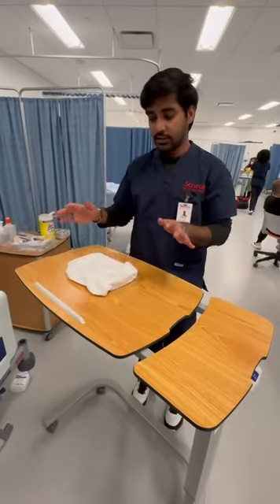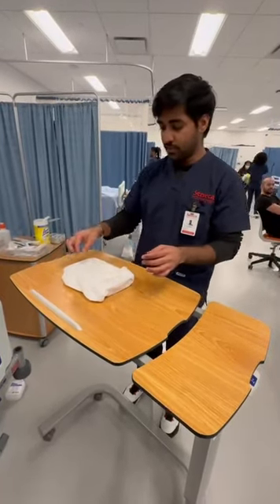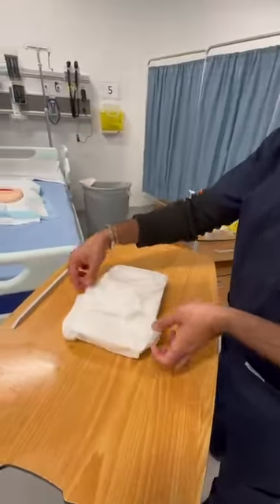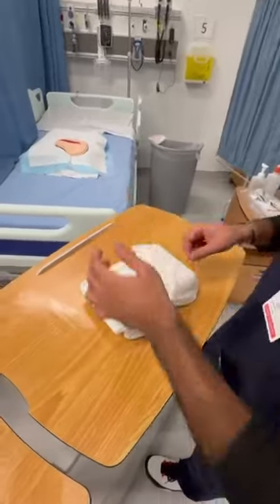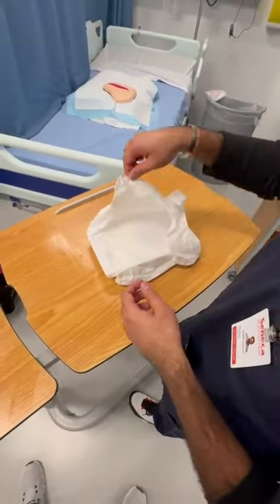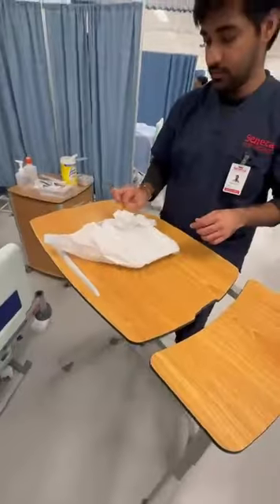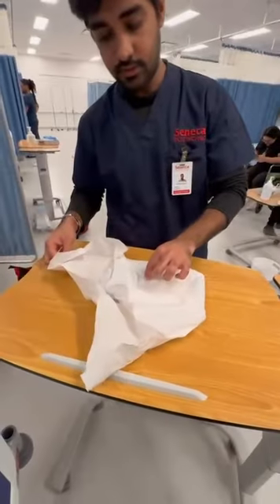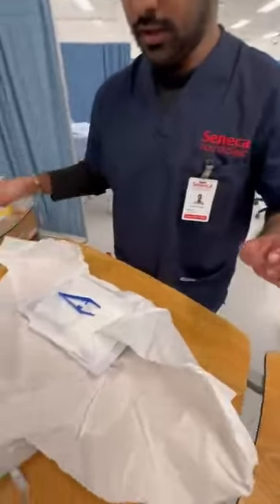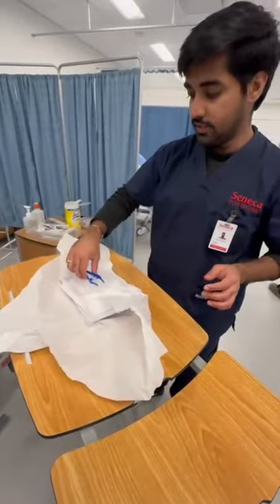Okay, so this is my package to install the sterile field. We're going to open it. Making sure I'm not touching anything under 2.5 centimeters. So this is the top fold. This is the side folds. Okay. So now that I have the forceps, I'm going to use the forceps to touch any sterile field.